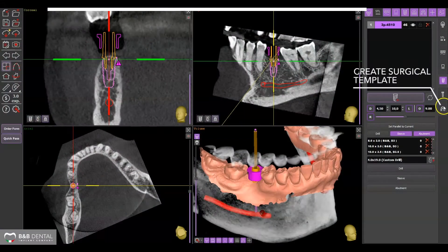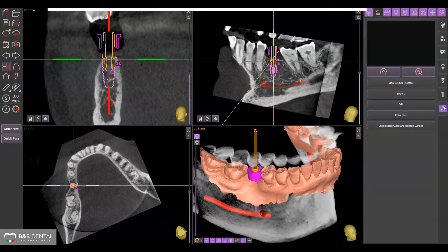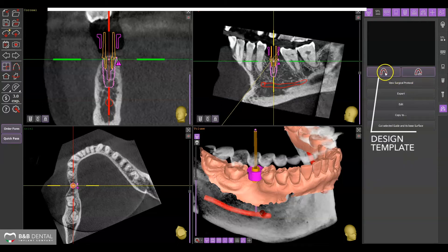Once the implant is positioned for the design of the surgical template, select the last tab from the right panel and click on the design template icon.